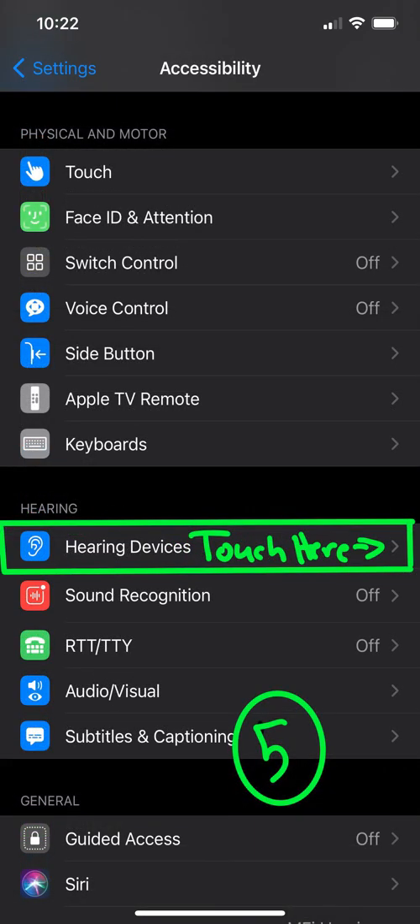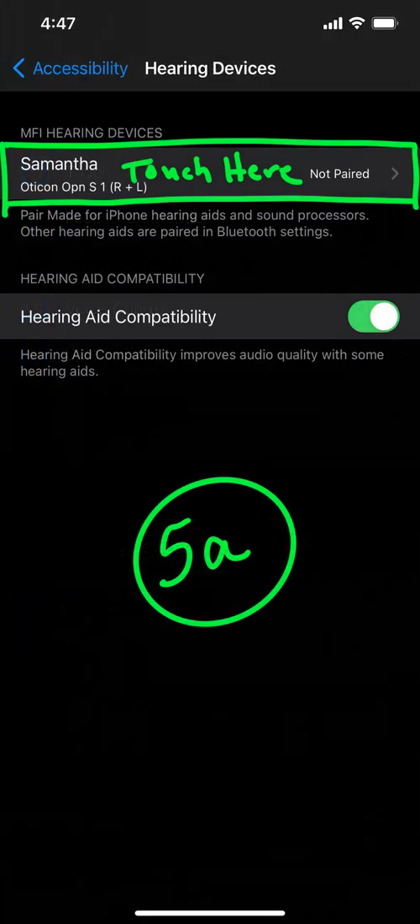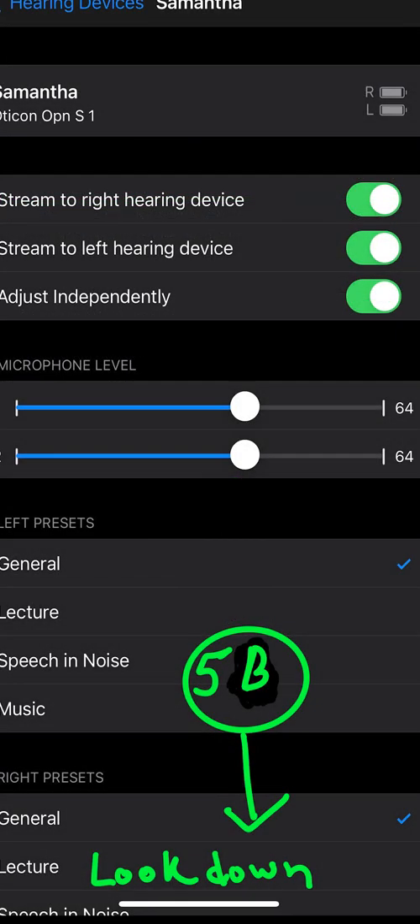Number five A: you'll find your name and your device name, and it will have an R plus L and it will say 'not paired.' You will touch there and that will take you to five B.